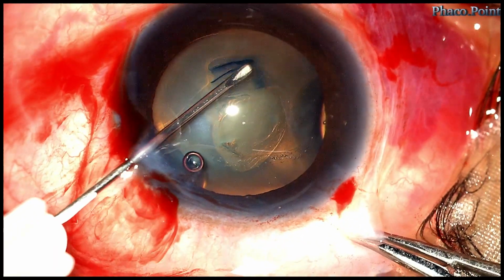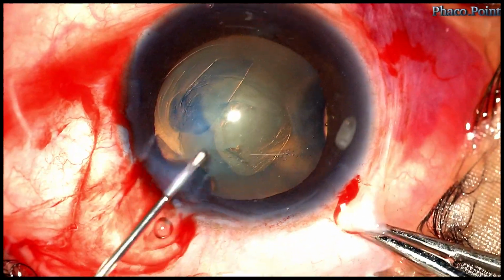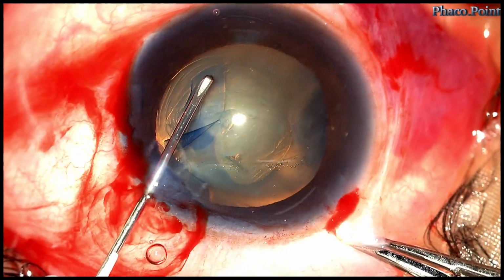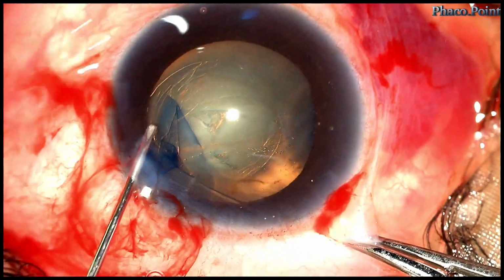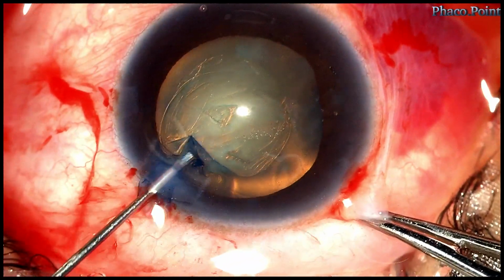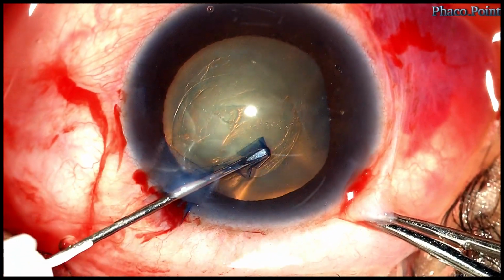Since I don't see too many folds in the anterior capsule and I'm able to proceed with the capsular rhexis, I don't need to resort to the use of any hooks to support me in making the rhexis. With significant ease, I'm able to complete the capsular rhexis in this case.